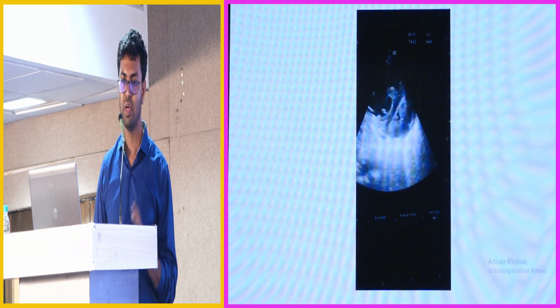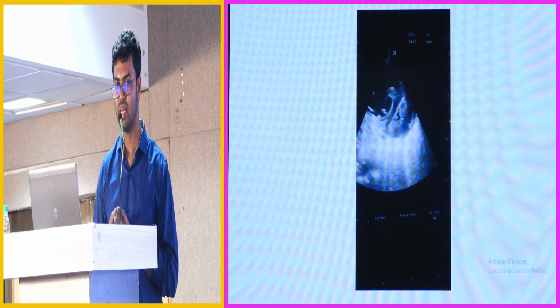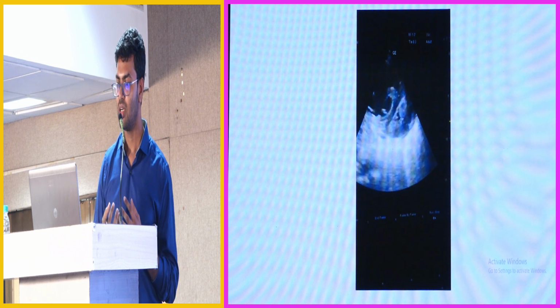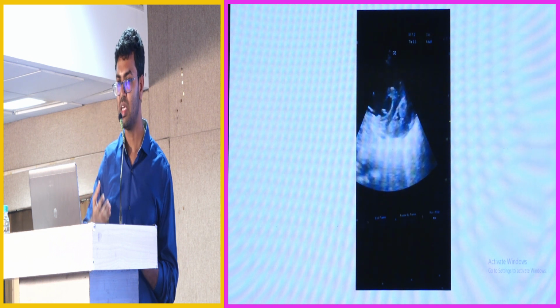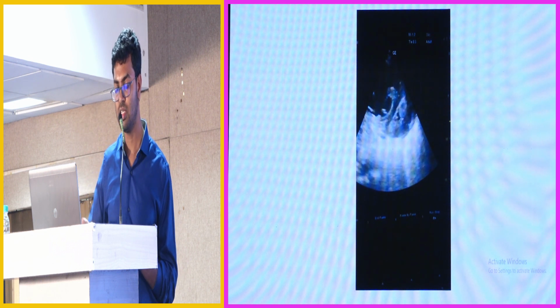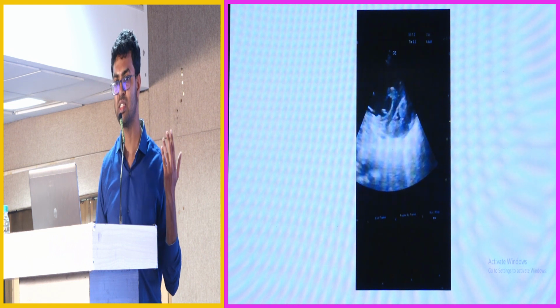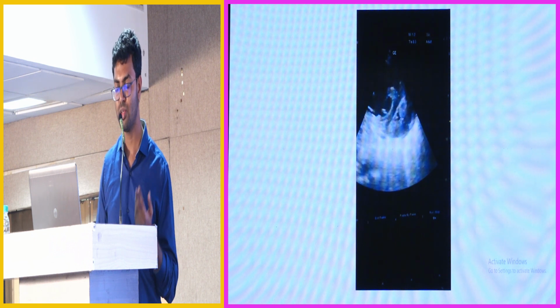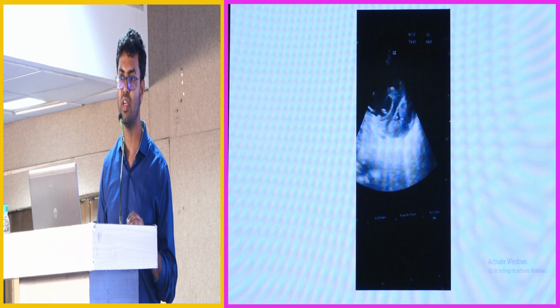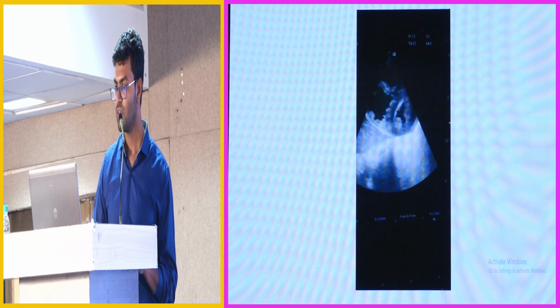So you have placed the ECMO in this patient, and you have seen that the saturation improved initially. Then after some time, in this ILD patient, the saturation started to fall, and the BP also started to fall. We checked the X-ray for the distance between the SVC and IVC cannulas, but the BP kept falling and we didn't know the reason. Every intensivist should know echocardiography, so we did an echo.